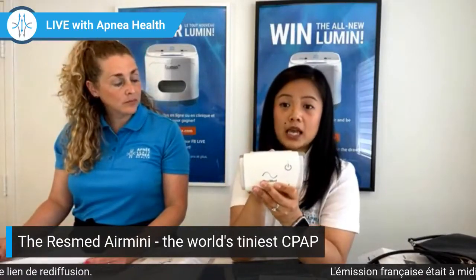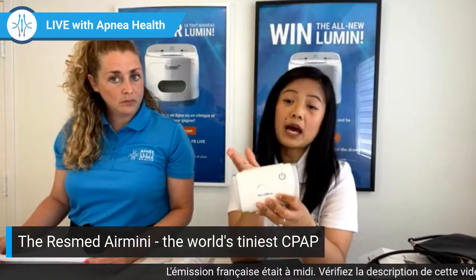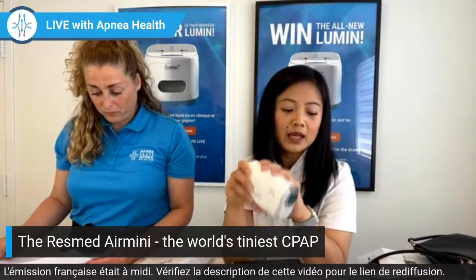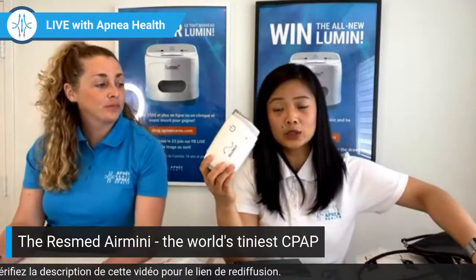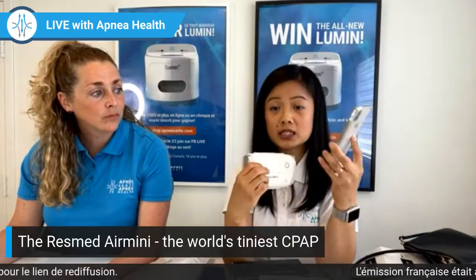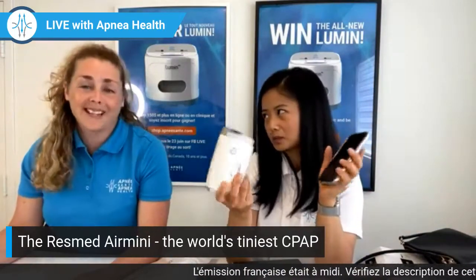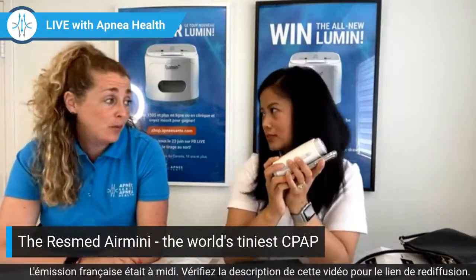And the Airmini can be configured in CPAP, fixed pressure, or APAP, which is an auto variable pressure. That has to do with your prescription. And lastly, it has Bluetooth. So you can download an application on your phone and trend the results, the quality of your sleep, on your phone. So that's something fun. Yeah, it is. And we are in the era of technology. Everybody's on their phone. So it's really fun to have.